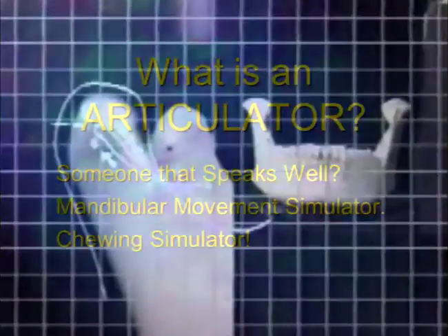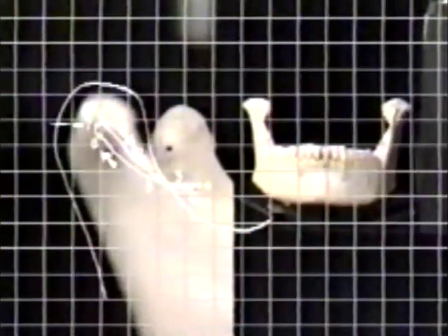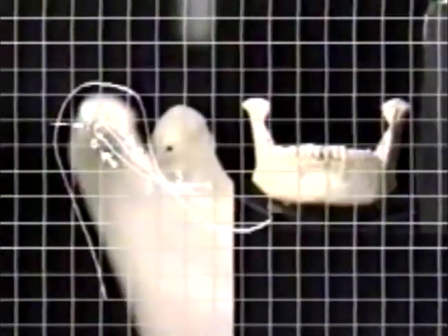The computer plots reveal some interesting differences between the right and left condylar movement patterns. Upon opening, the working side translates along a course that is often superior to its closing movement. Distraction, or separation of the working side condyle from its temporal articulating component, is a common occurrence.